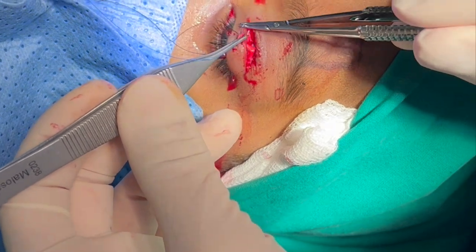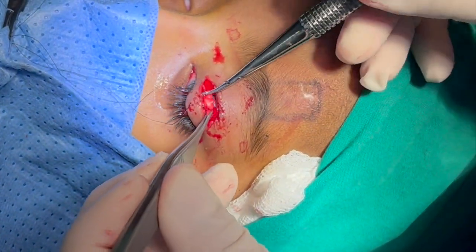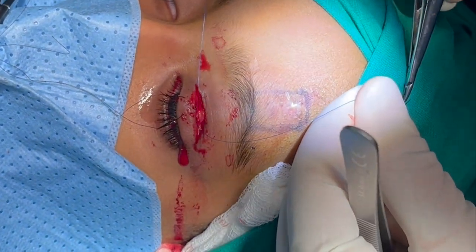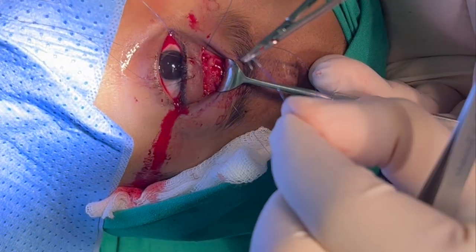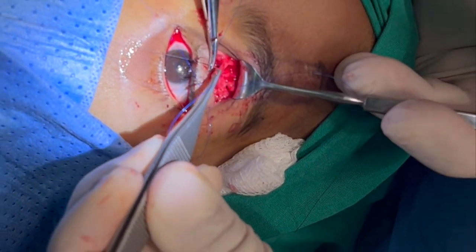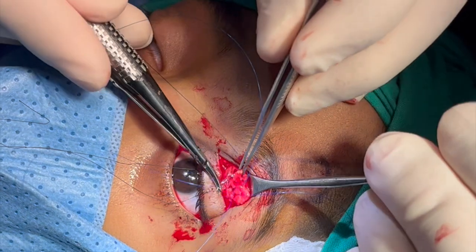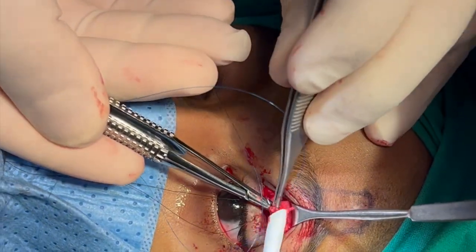5-0 Prolene sutures are passed through the tarsus partial thickness, and then through the levator muscle, and then through the frontalis muscle flap on the medial aspect of the flap.